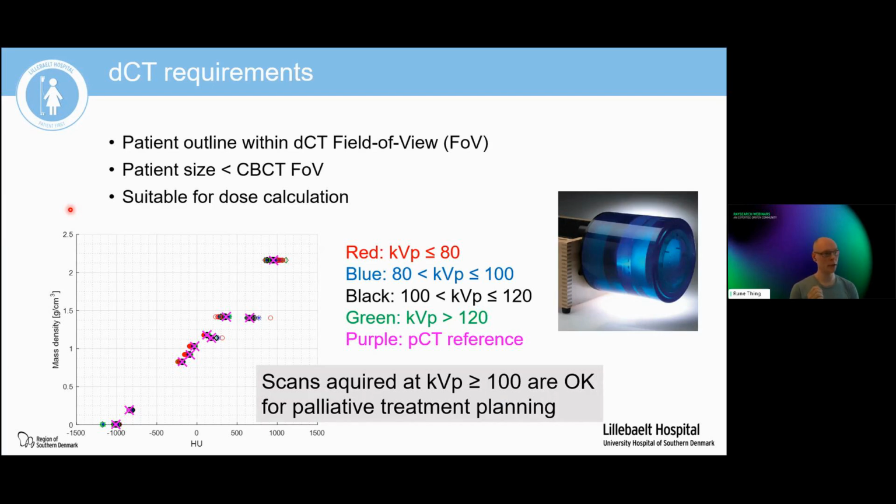Note again here, the keyword is palliative treatment planning. It might not be all right for curative treatment where you want to eradicate the last cancer cell, but for palliative treatments, the uncertainty associated with making this decision we consider to be just fine.